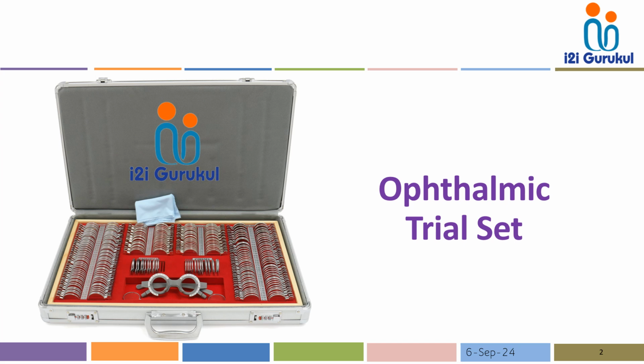Friends, we'll begin with the topic, that is the ophthalmic trial set.